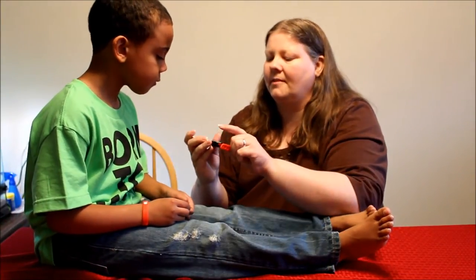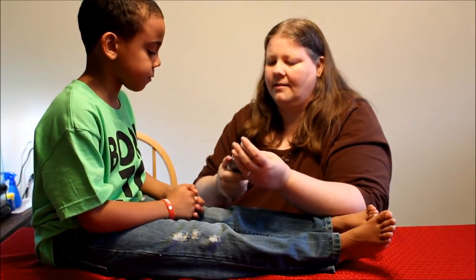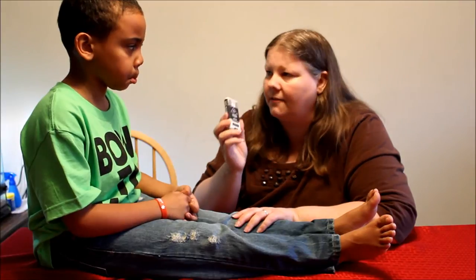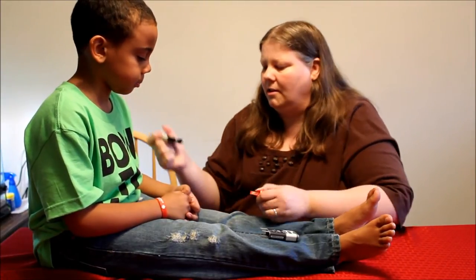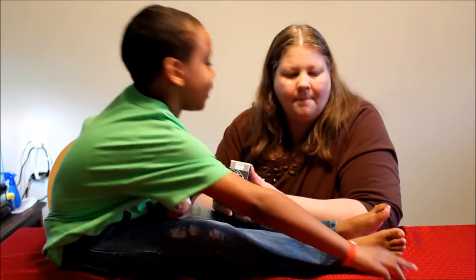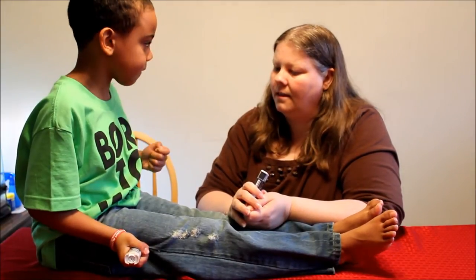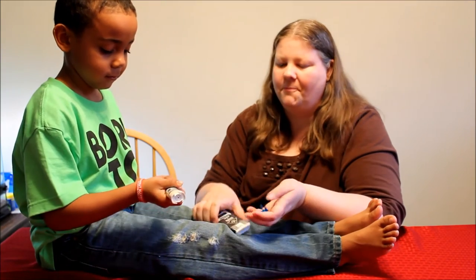The wonderful thing about this is that it goes at your pace. If you know what you're doing, you don't have to wait for the instructions — it catches up to you and tells you what to do. When you pull it out and inject quickly, it just knows because you were quicker. This is an awesome tool because it goes at your pace.